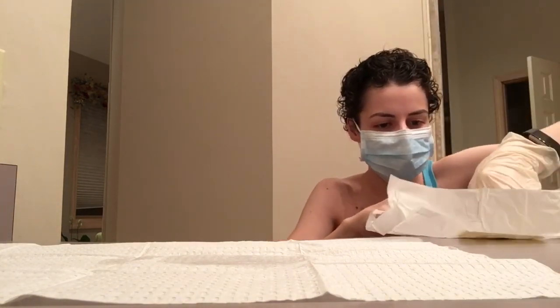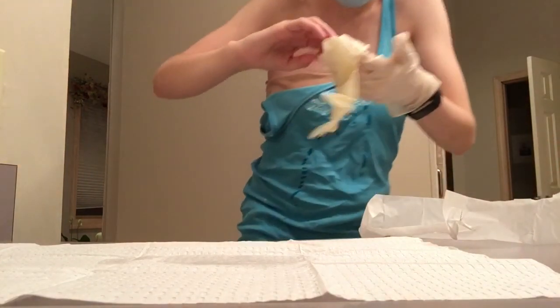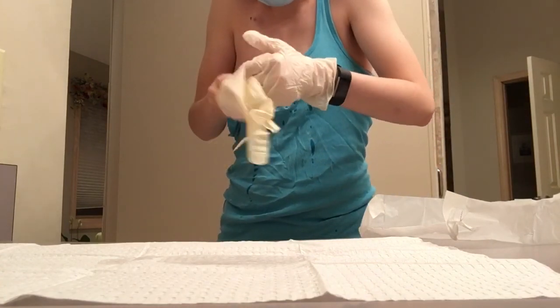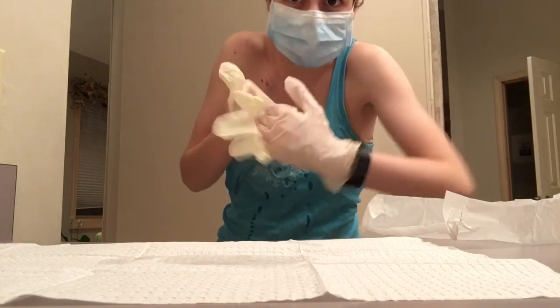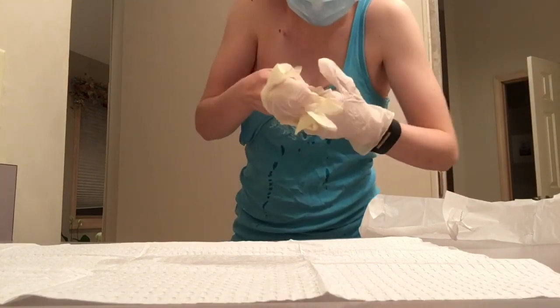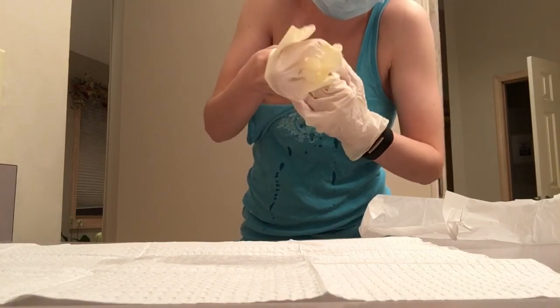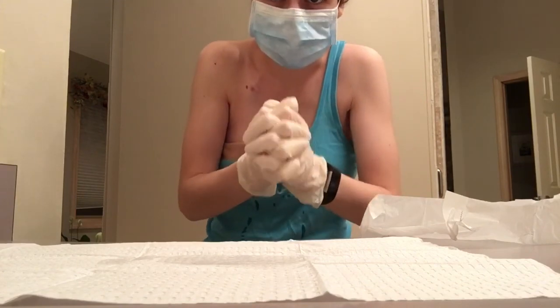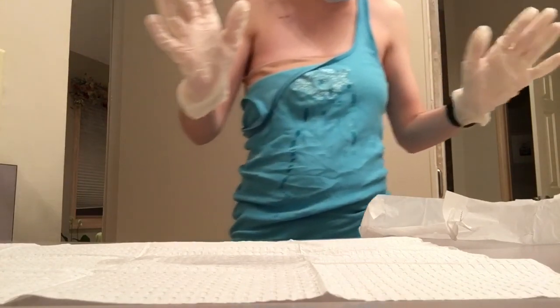Now, I'm doing the opposite because this hand is sterile and only touching the inside of the glove with this hand and the outside of the glove with this hand. And you just have to, of course, make sure the fingers are lined up, which is usually the hardest part. And then my hands can touch each other. They can do that, which is good.